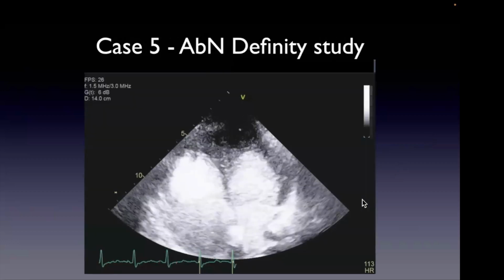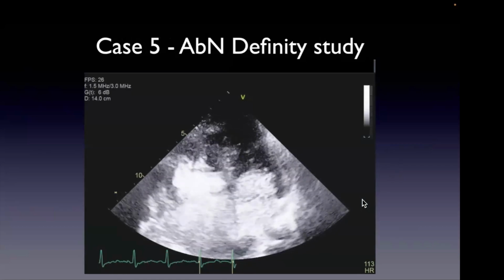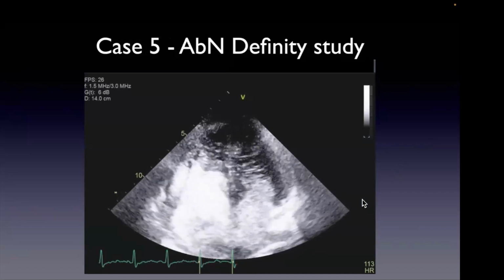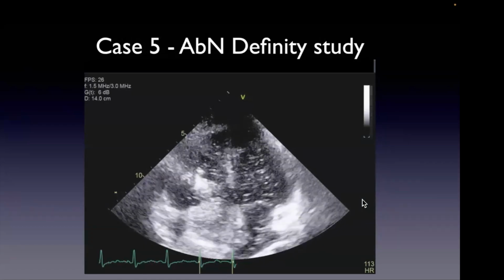Okay. All right. So this is a DEFINITY study done side by side. Right and left, yes. I like Grace is thinking way outside the box. Like way outside. Both arms.